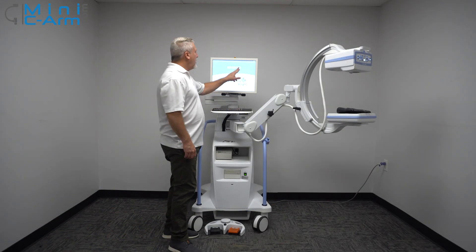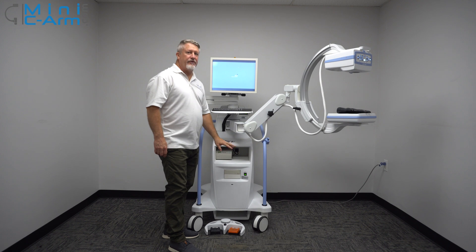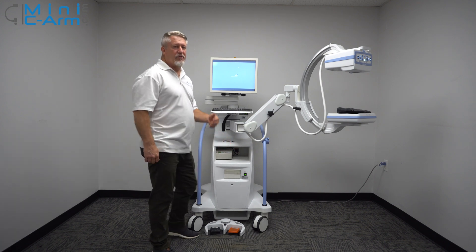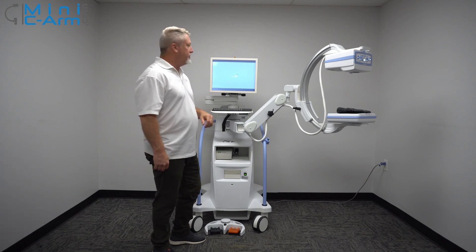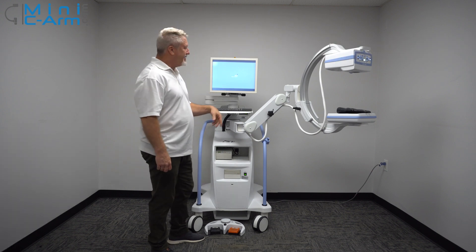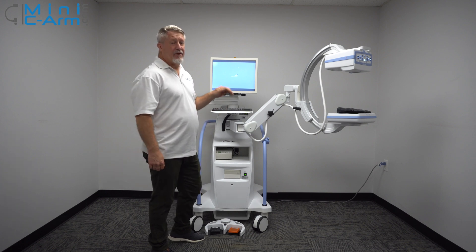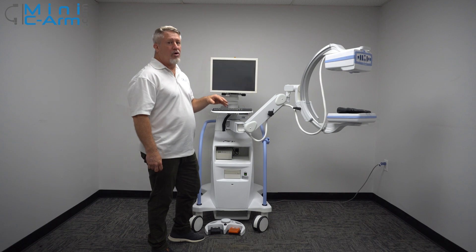Always shut the machine down from the screen. Please do not use the on/off button, because that doesn't allow Windows to shut down properly, and in time it'll start giving you issues. Once the screen goes black, unplug it from the wall. Try not to keep this plugged in all the time because there are certain components that are totally powered all the time.